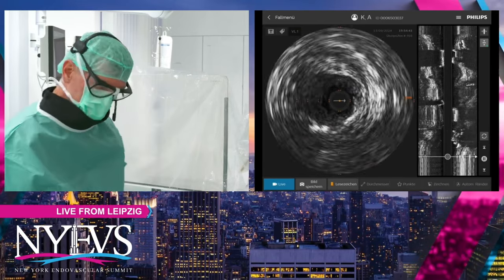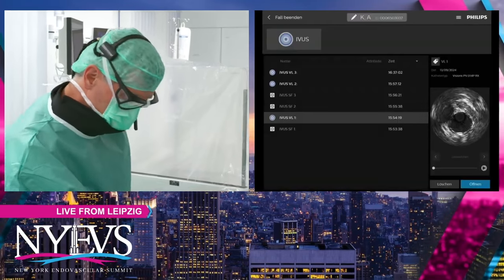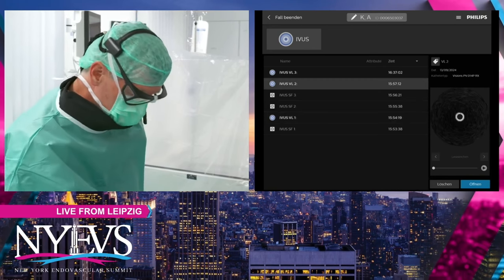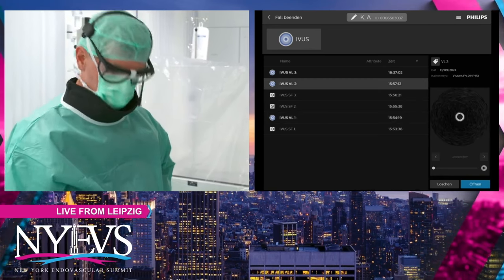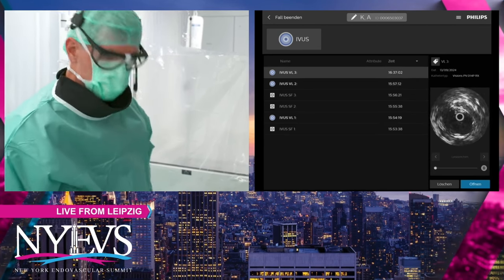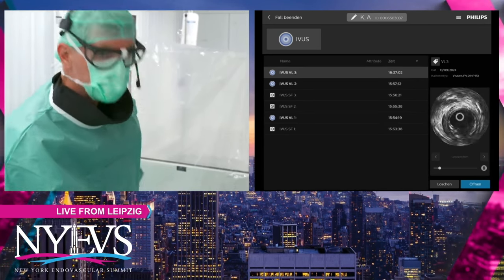Andre and his team are obviously experts at this, but it looks fantastic. What's the plan now at this point? Do you even need to put in a stent? No, I think we're going to leave it like this. This is afterwards once again.